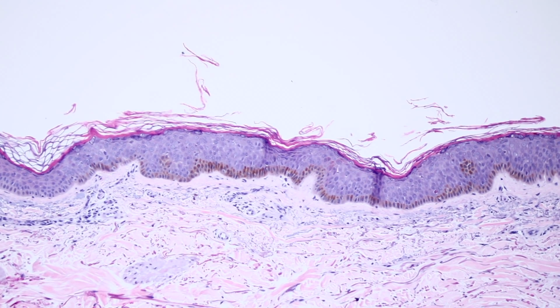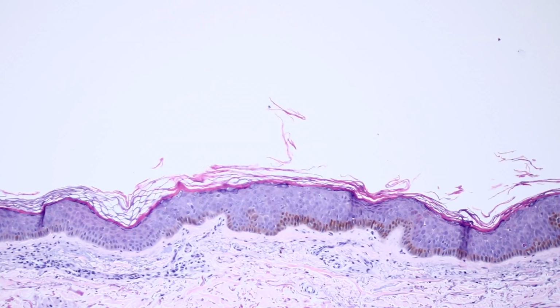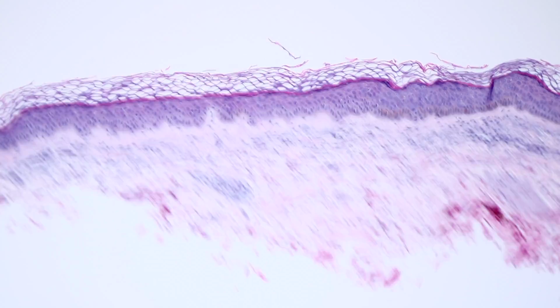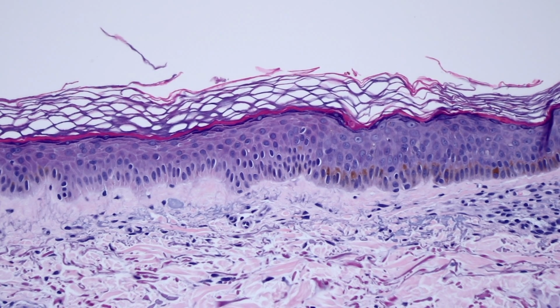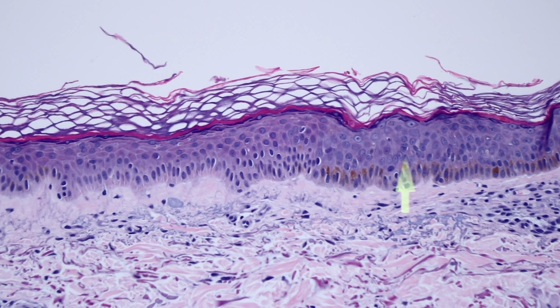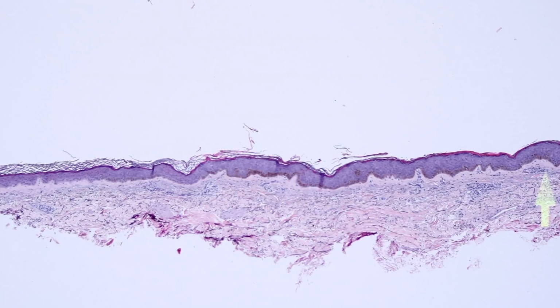So this is a really nice example of a pigmented squam in situ that can actually be kind of subtle. Here you can see this is a nice transition here. But I think these are easy to miss if you're not paying attention. There's normal, and now you see the difference? You go from normal right here, and then all of a sudden, that's where the squamous cell carcinoma in situ starts, right there. And this is a nice pigmented squam in situ. But again, look at that from lower power.